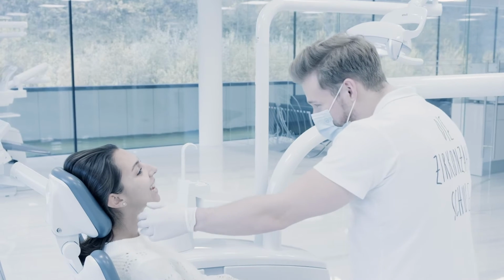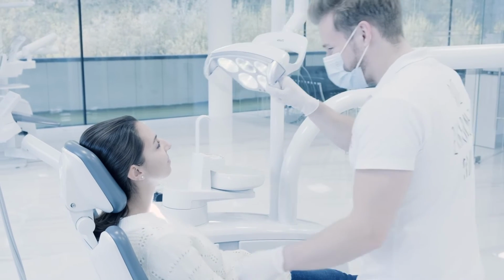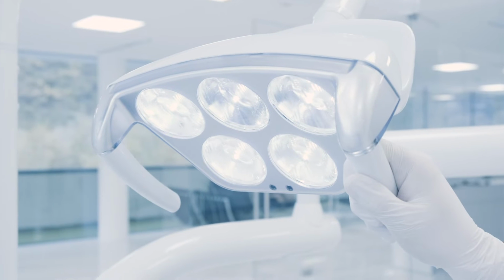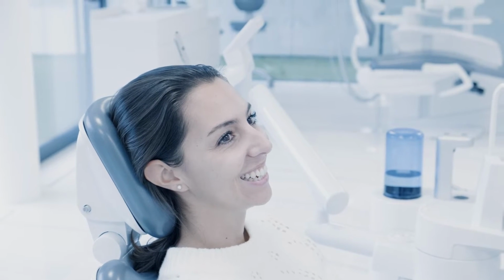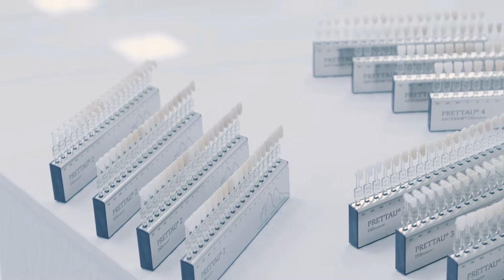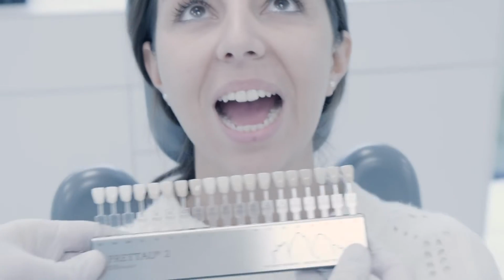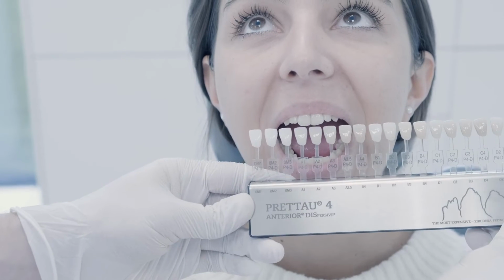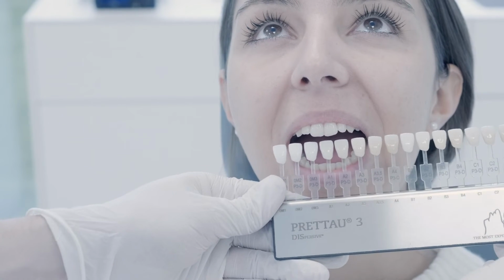Ideally, the color determination should be carried out under natural daylight, or in a room illuminated with standard daylight lamps, avoiding direct bright light. Human teeth have different degrees of opacity, from quite transparent to very opaque. With the 3 Prettau dispersive zirconia types, 3 degrees of translucency are available. In addition to Prettau 2 dispersive and Prettau 4 anterior dispersive, the new Prettau 3 dispersive zirconia is also available.